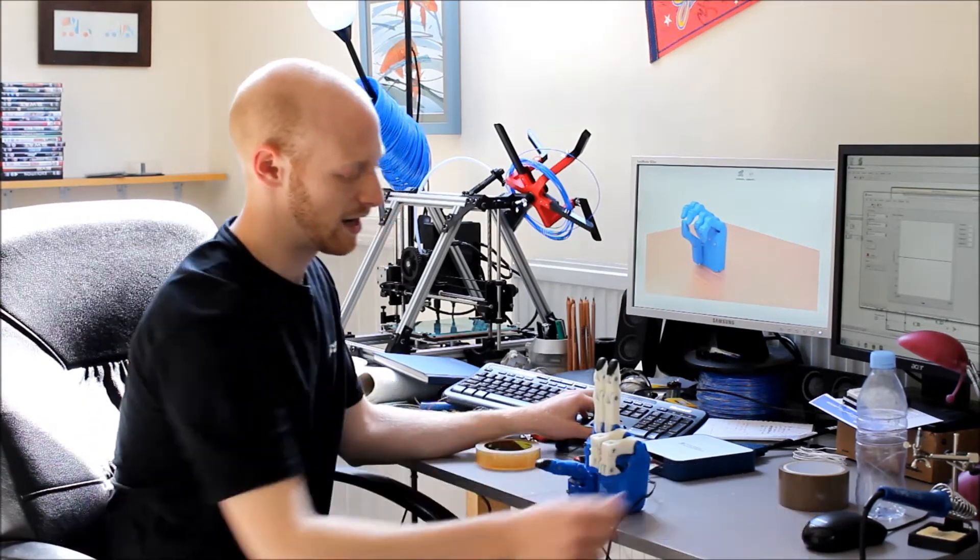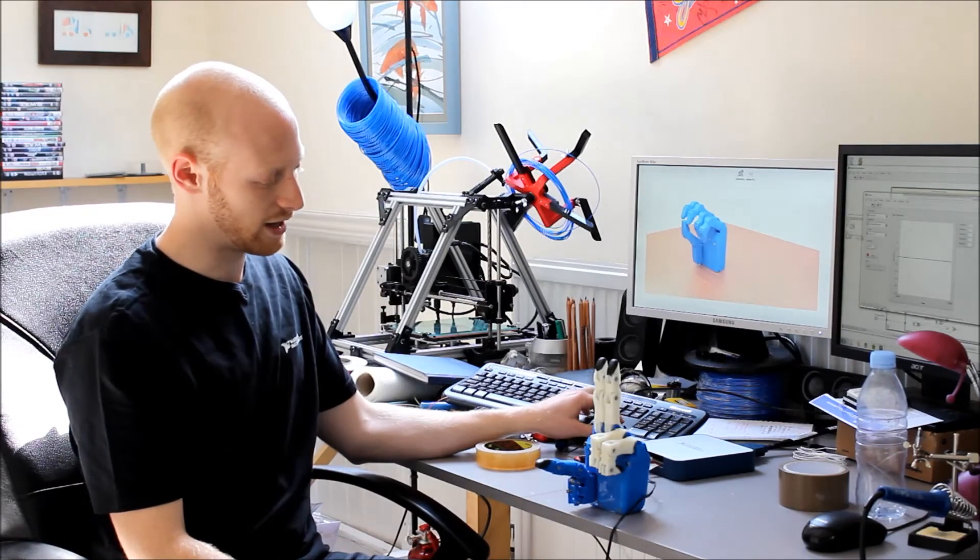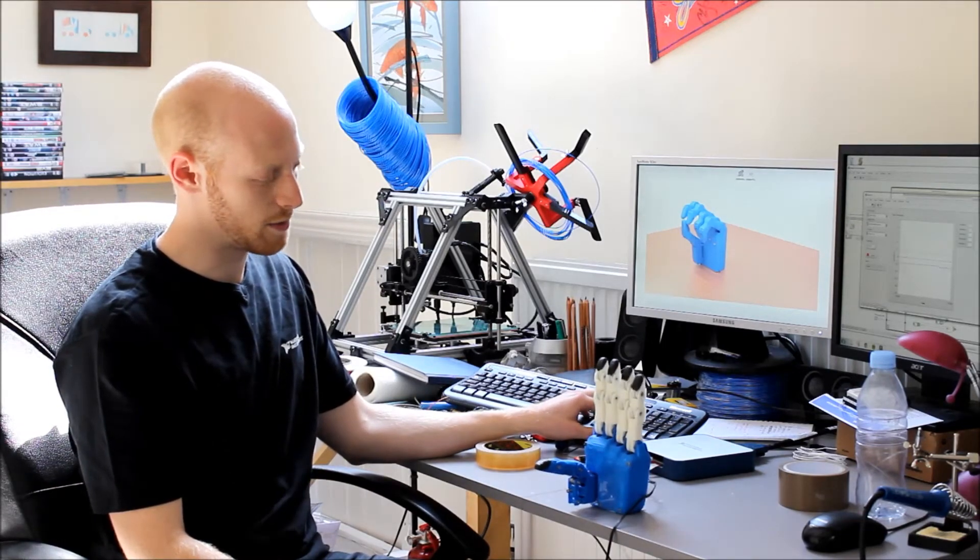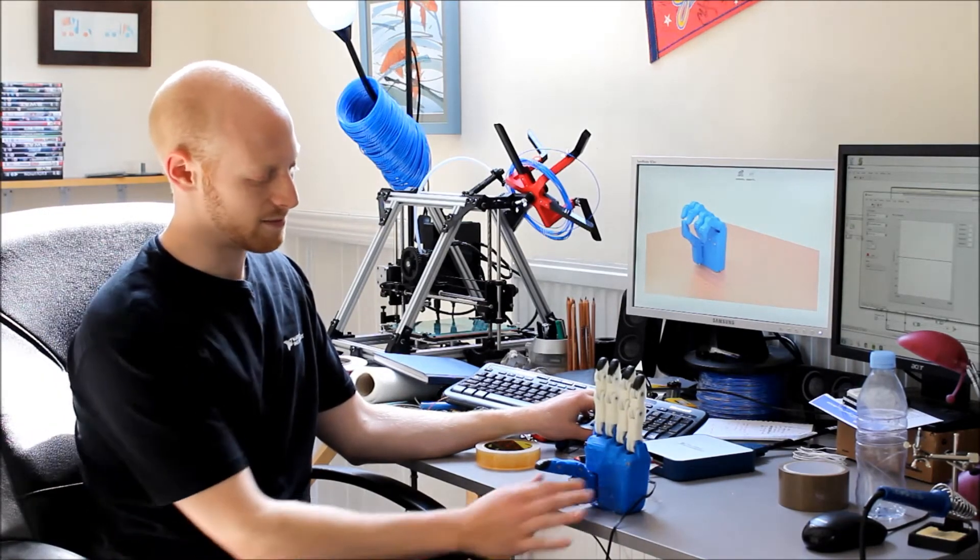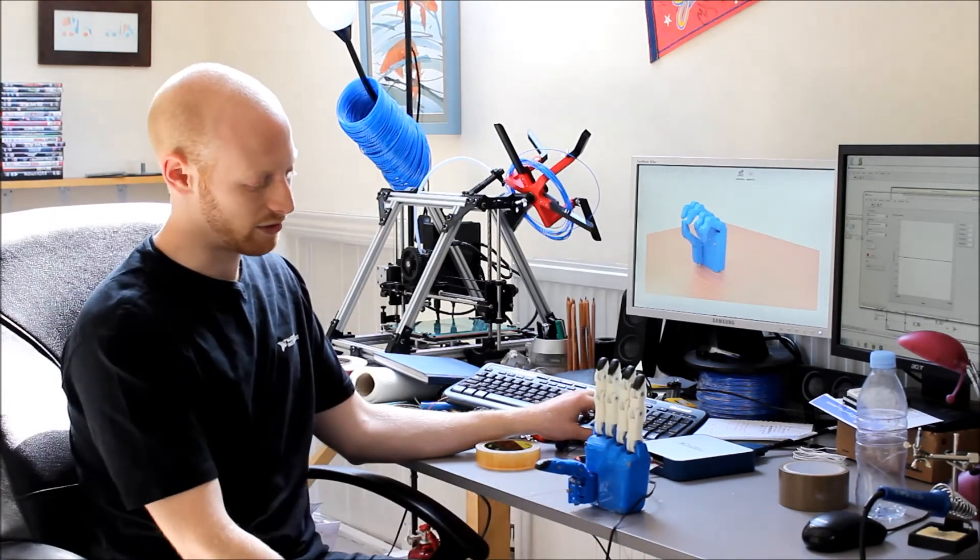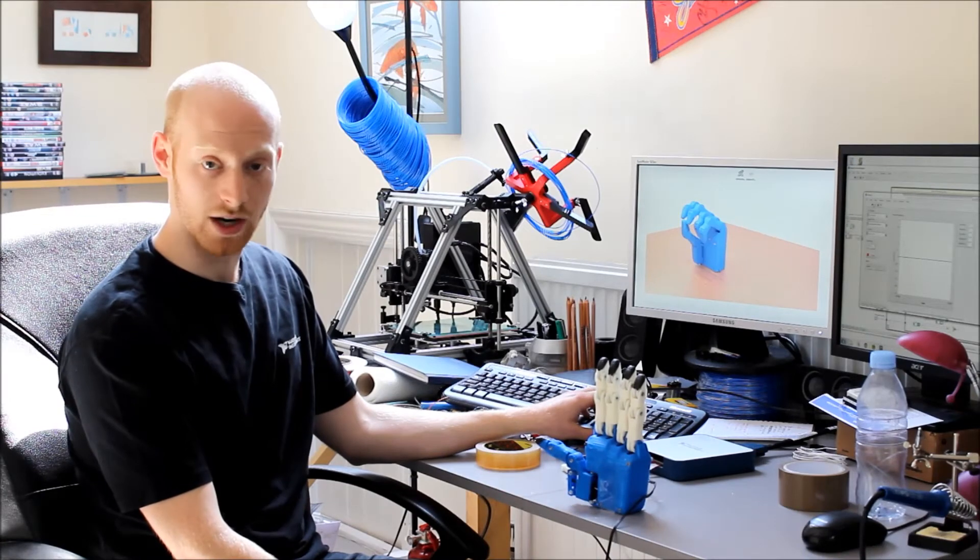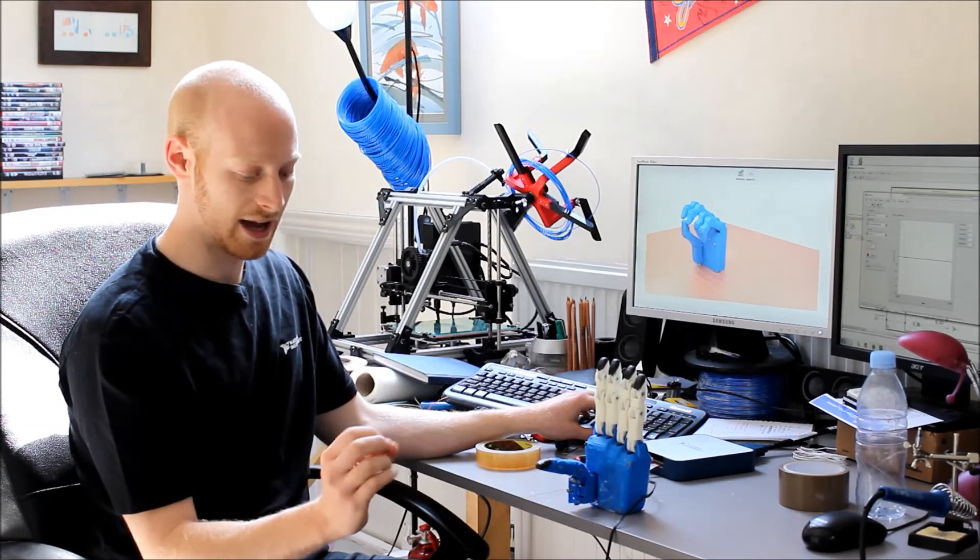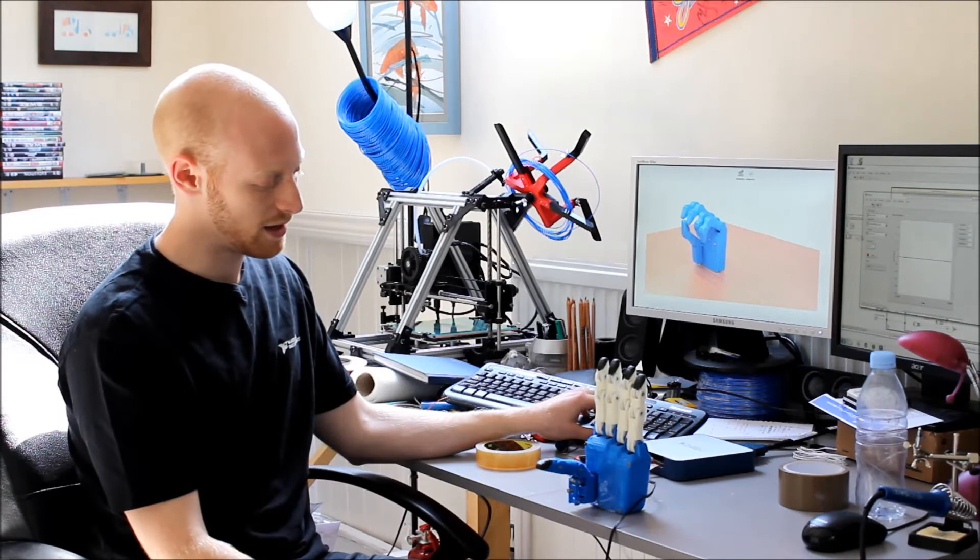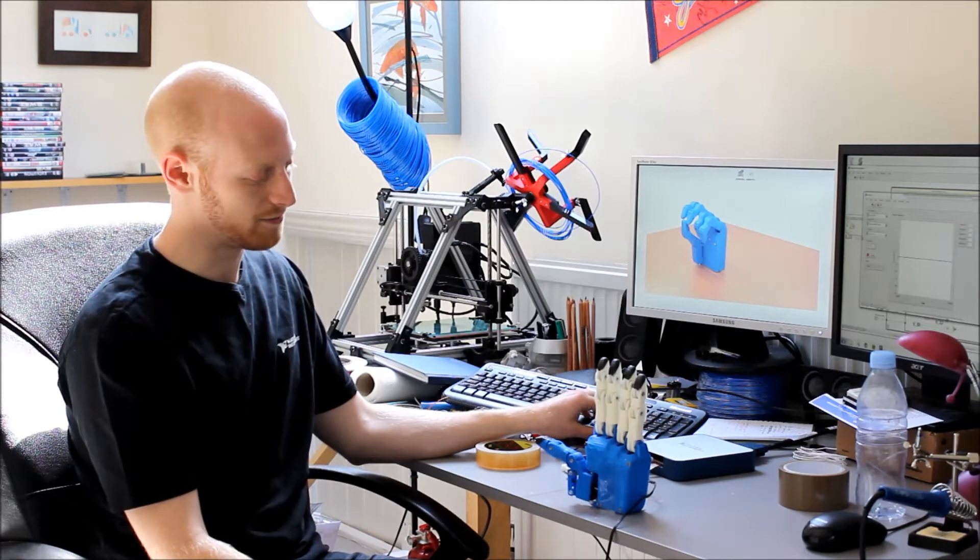And then another thing that I can do, if I open the hand again, is move the position of the thumb. So I can move that between this full hand grasp and having it in this position.